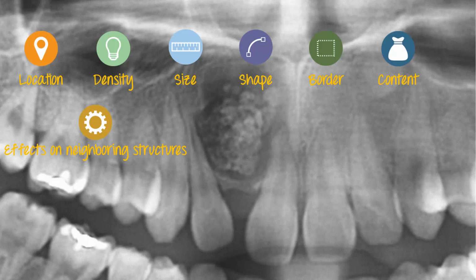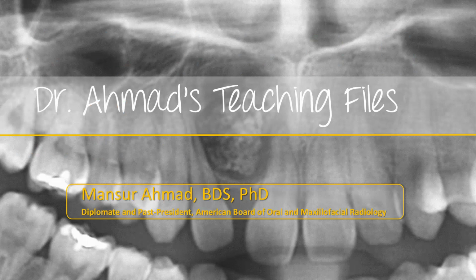Each of these radiographic features will tell us a story, will give us clues in making a diagnosis. I'm absolutely sure when you practice these 7 features, your radiographic diagnosis will become much better.